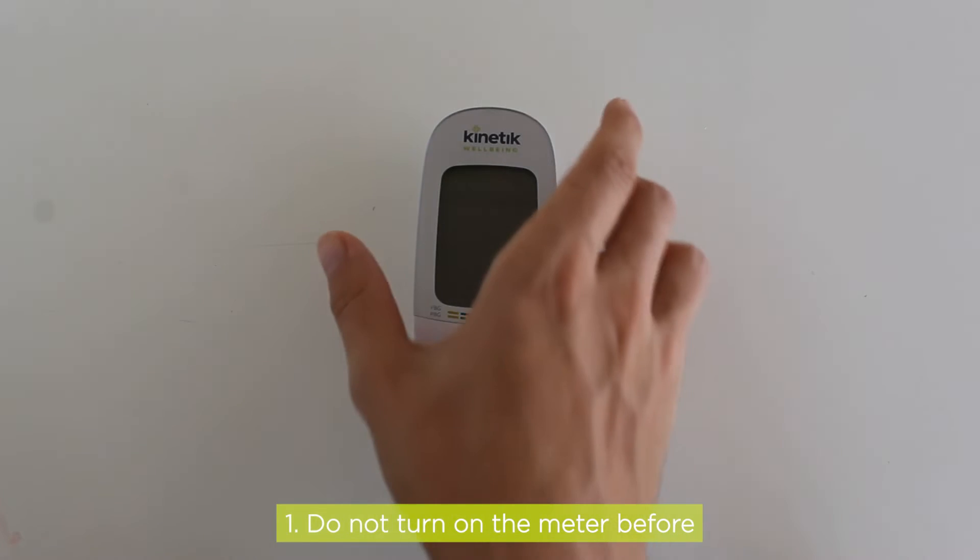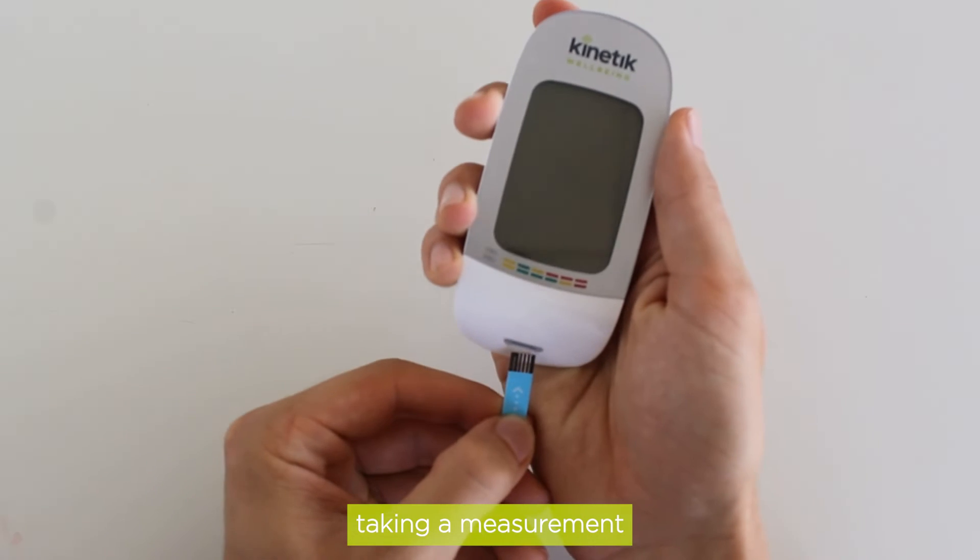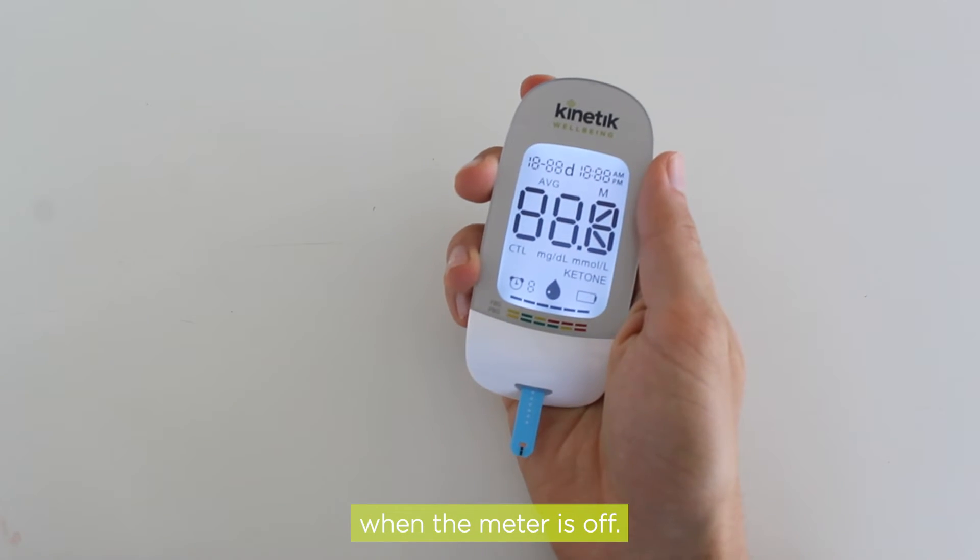1. Do not turn on the meter before taking a measurement. To take a measurement, simply insert a test strip when the meter is off.